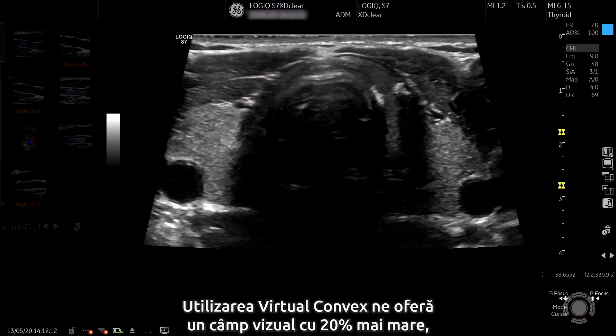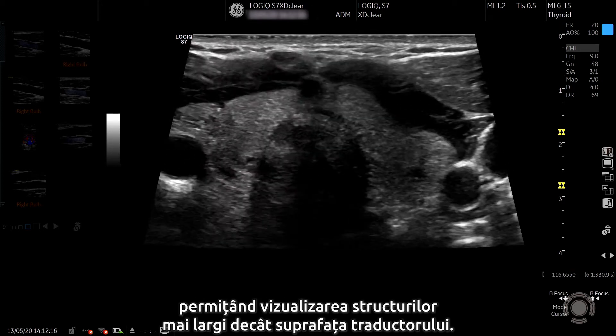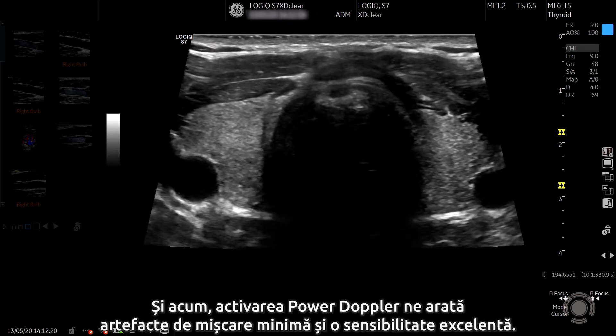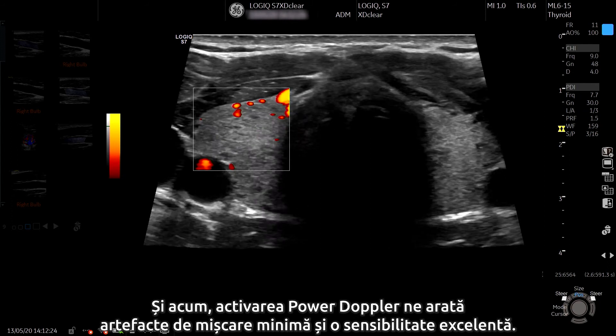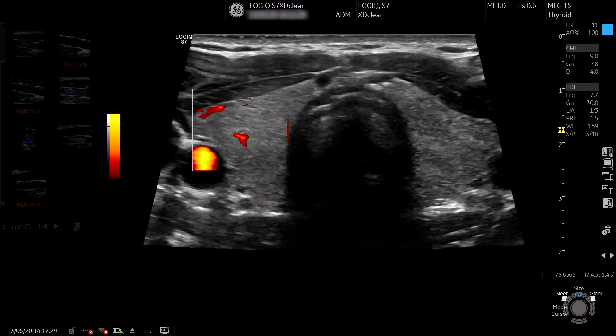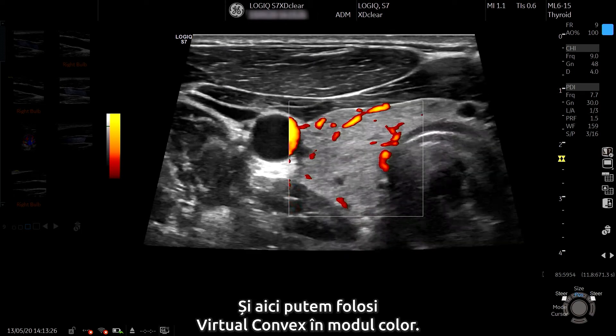Using virtual convex gives us 20% greater field of view, allowing us to visualise structures wider than the transducer face. Activating power Doppler shows minimal motion artefact and excellent sensitivity. We can also use virtual convex in colour mode.